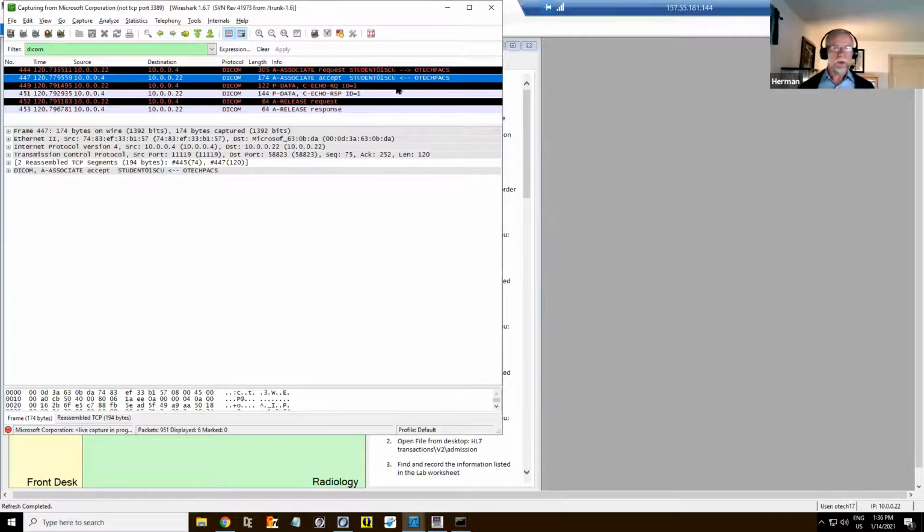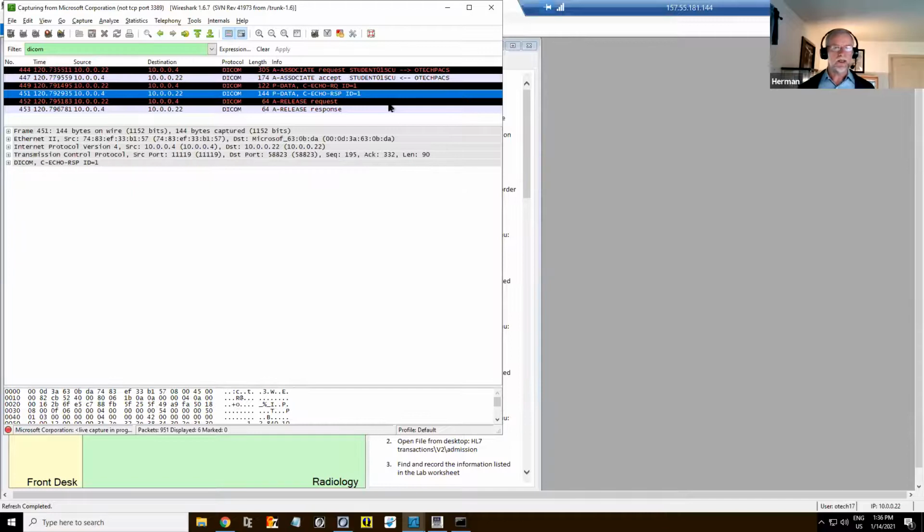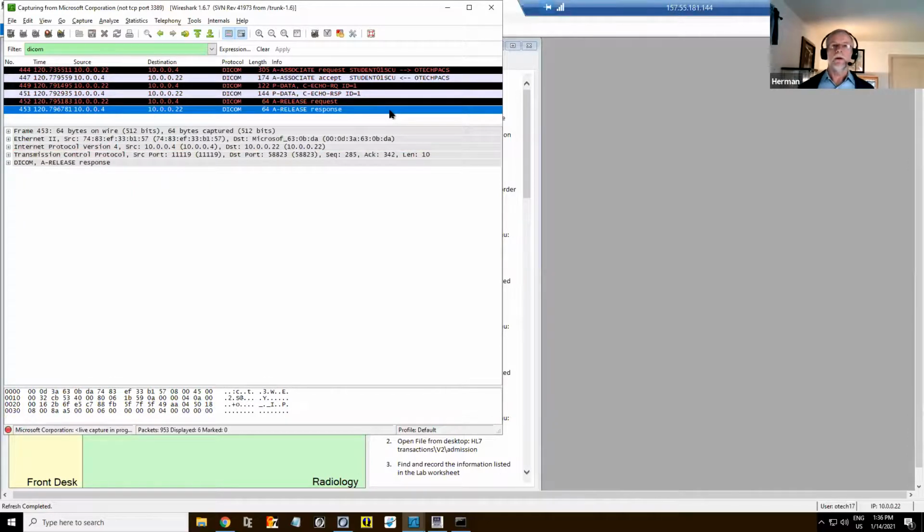We did an echo request and response, and then a release request and a release response. Wow, that's pretty cool. So everything looks perfectly fine. The next part, we use this frame: Ethernet, IP protocol, transmission protocol, DICOM. We're not interested in those, but we're interested in the DICOM.